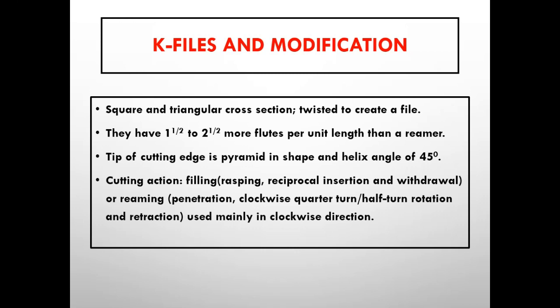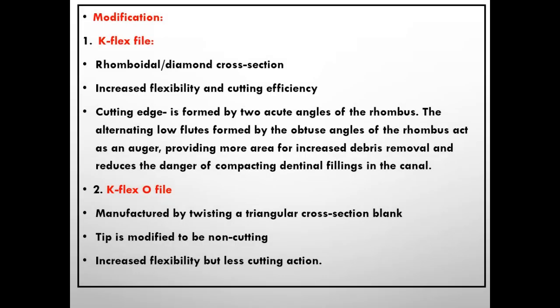The tip of the cutting edge is pyramid in shape, with a helix angle of 45 degrees. The cutting action will be filing or reaming, used mainly in a clockwise direction. These are K files, and the modification is the K-flex file.